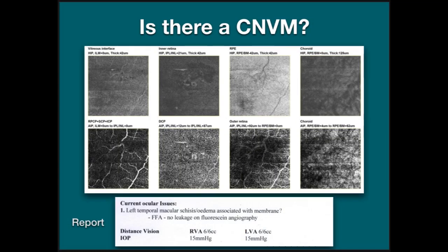So I did an OCT angiography scan on that region, non-central. We can see a little bit of the edema in the inner retina, but we're not seeing any new vessels in any of the layers. She ended up wanting to have a second opinion from a retinal ophthalmologist. I didn't really want to refer her because the edema was non-central and I didn't see any new vessels.